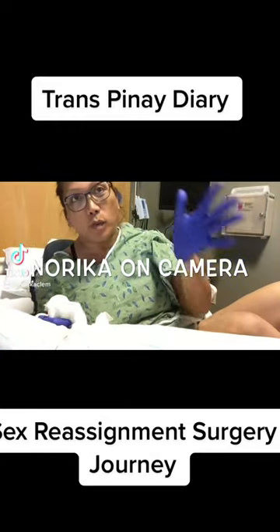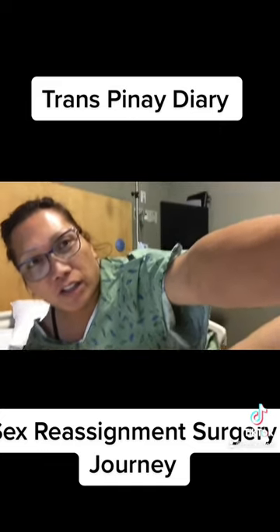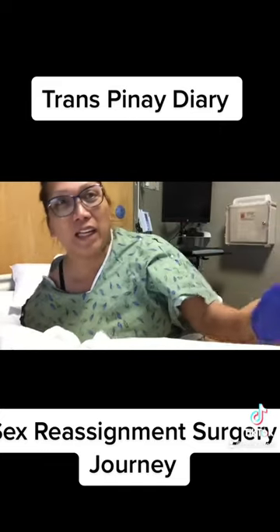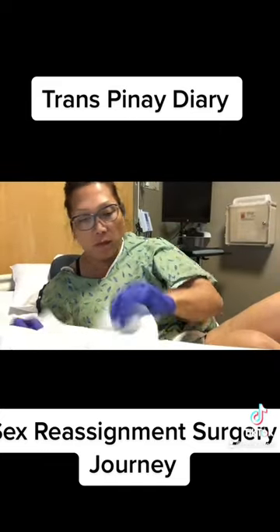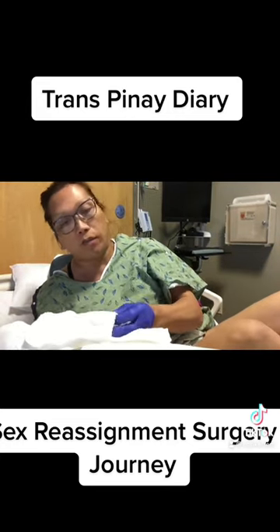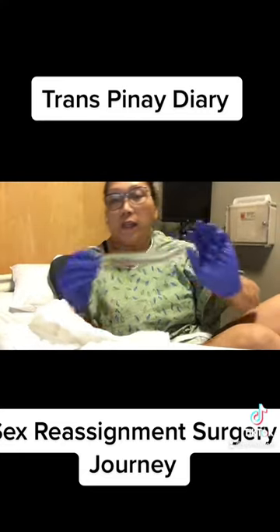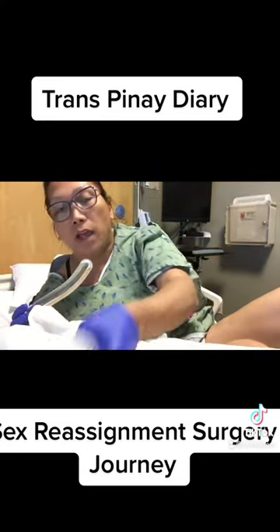Hi, hello guys. Good morning — I just woke up, so it's time for me to do a dilation again. Another set of dilation. This time I'm gonna show it to you guys. Sorry, I just woke up and it's eight o'clock. I have to do it, so I have to start with one.